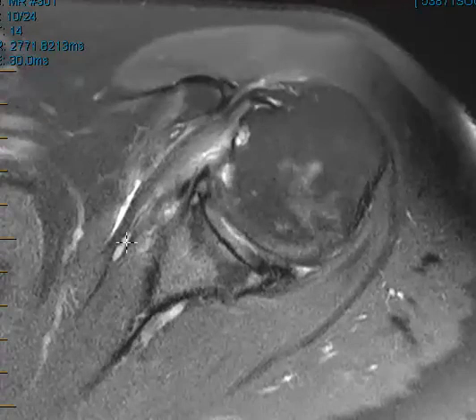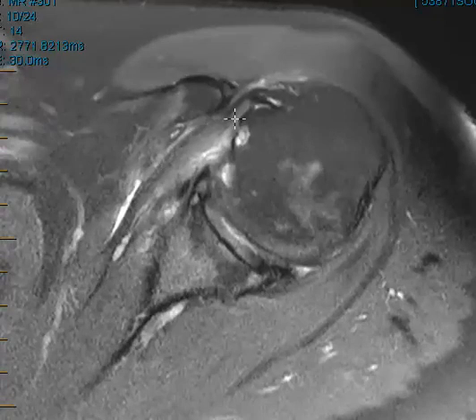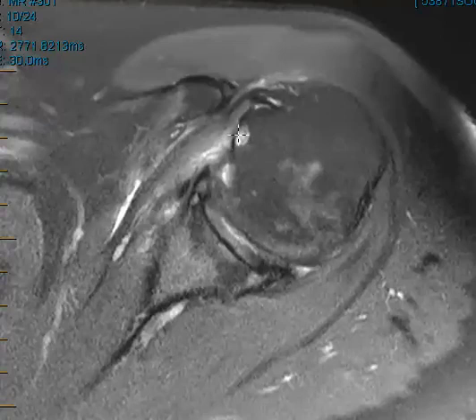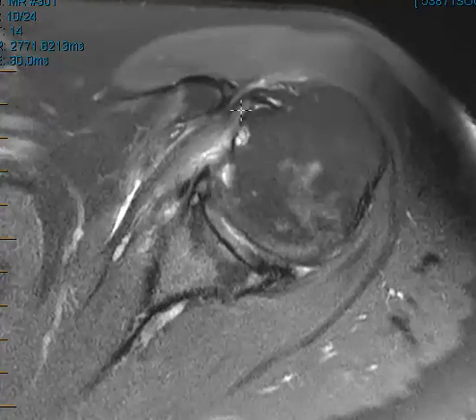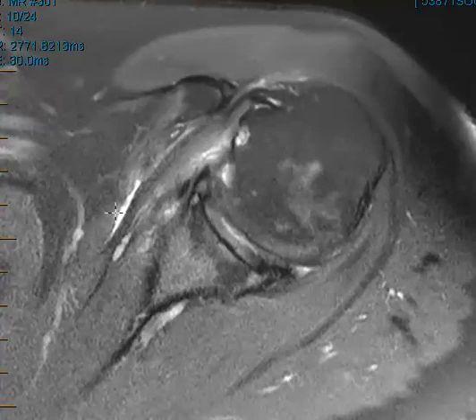all the way from the musculotendinous junction here, all the way to the lesser tuberosity. You can see these associated cystic erosions at the attachment of the lesser tuberosity — so diffuse tendinopathy, hypertrophic tendinopathy, and also this little fluid here tracking.